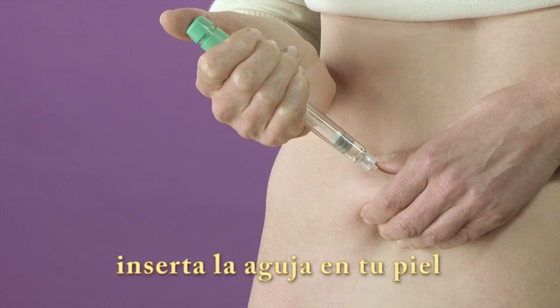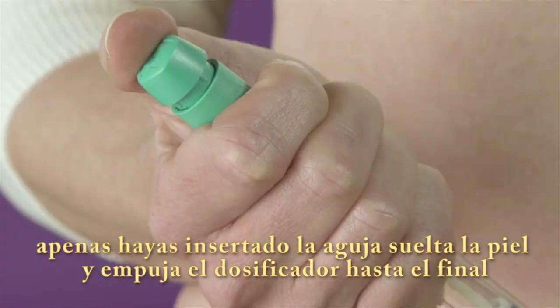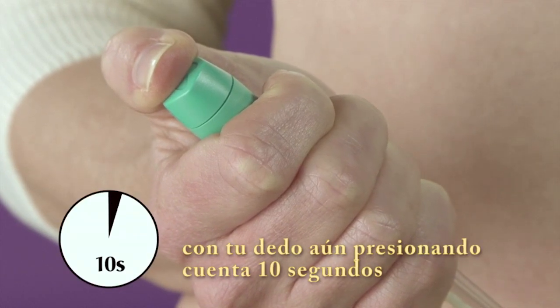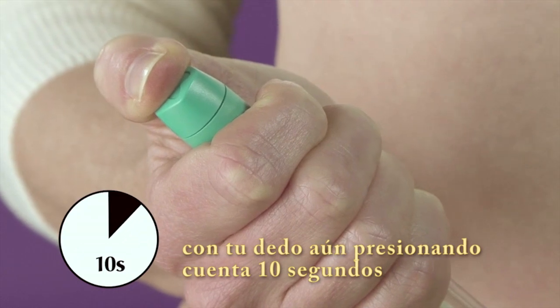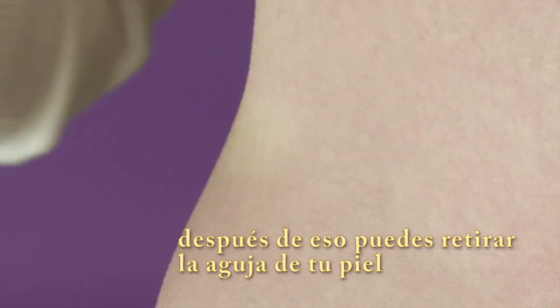Insert the needle into your skin. Once you have inserted the needle, you can release the skin. Push the dose setting knob right to the end. With your finger still pressing the dose setting knob, keep the needle in the skin for 10 seconds. After 10 seconds, still keeping the dose setting knob pressed down, take the needle out of the skin.